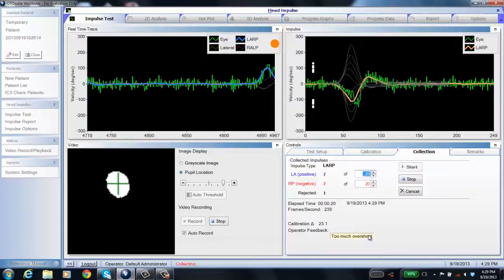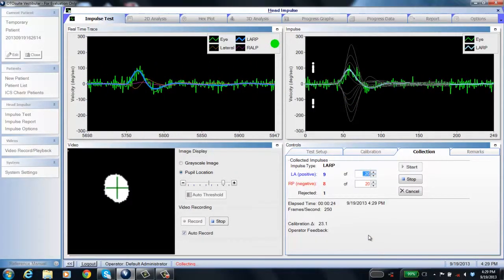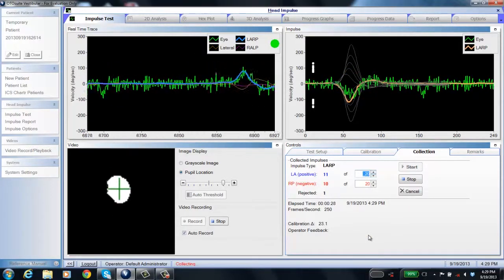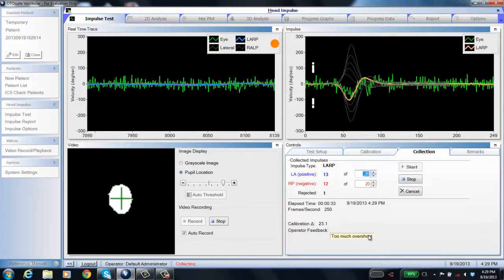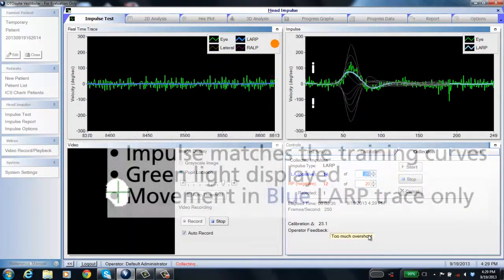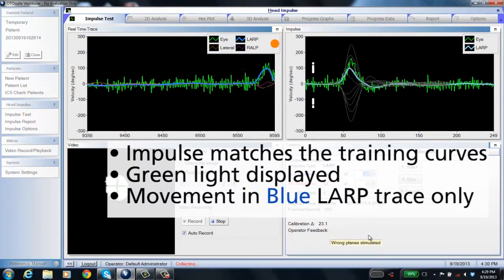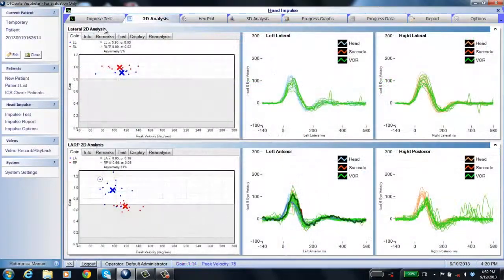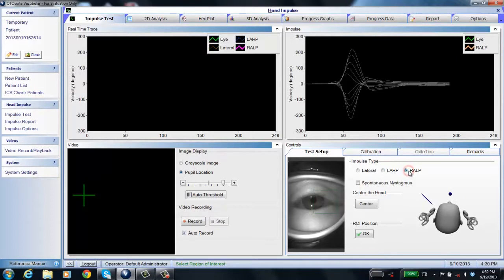This 'wrong plane stimulated' message is new in version 2.0. Your impulses should match the training curves, you should see the green light, and movement should only appear in the LARP blue head trace. Once you're done with LARP, move on to RALP — right anterior, left posterior.